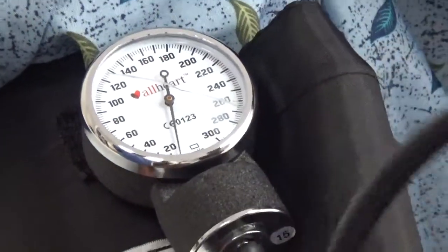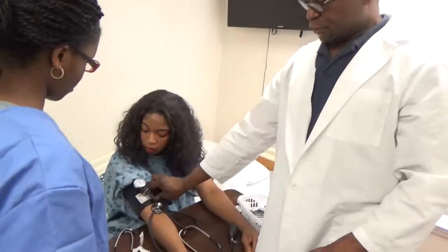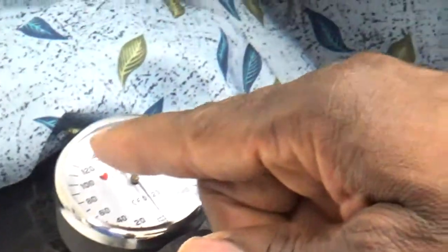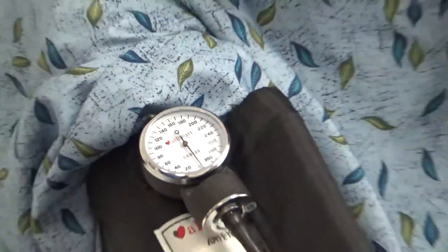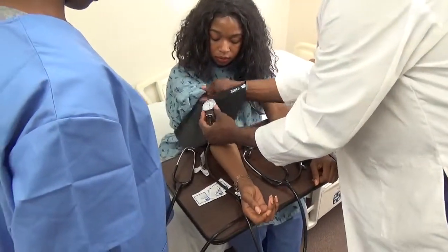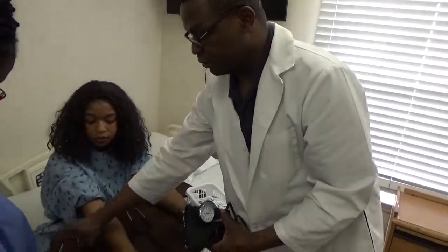Once you can deflate, and it gets down to about 40, the sound will fade away. You are looking at the meter go down as you deflate it. Where you hear the first sound — that is going to be your systolic. And where you hear the last sound is going to be your diastolic. Then unlock the cuff. This reading of blood pressure was 110 over 56. You can tell the resident what the blood pressure was.